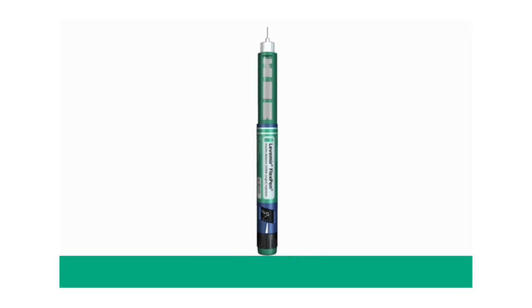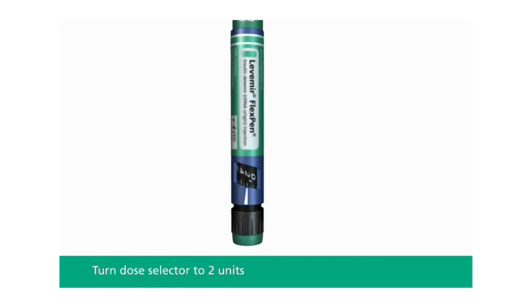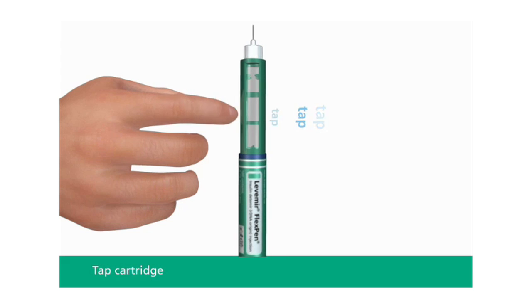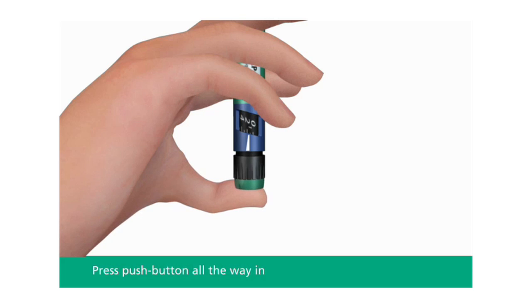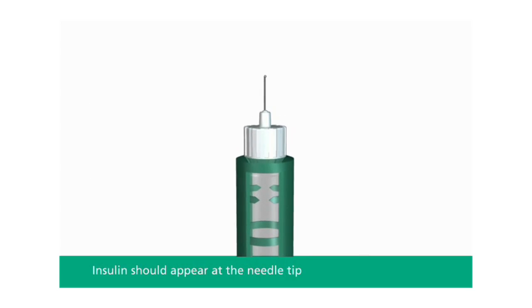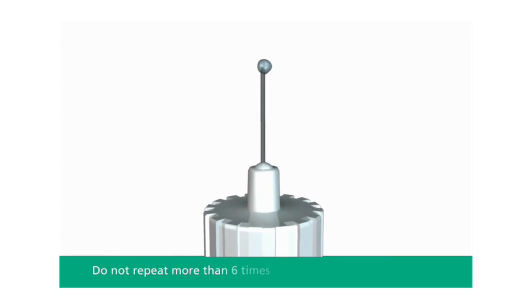Before each injection, small amounts of air may collect in the cartridge during normal use. To avoid injecting air and to ensure proper dosing, perform an air shot. To do so, first turn the dose selector to select two units. Then hold your Levemir FlexPen with the needle pointing up. Tap the cartridge gently with your finger a few times to make any air bubbles collect at the top of the cartridge. Keep the needle pointing upwards and press the push button all the way in. The dose selector will then return to zero. A drop of insulin should appear at the needle tip. If not, change the needle and repeat the procedure no more than six times.